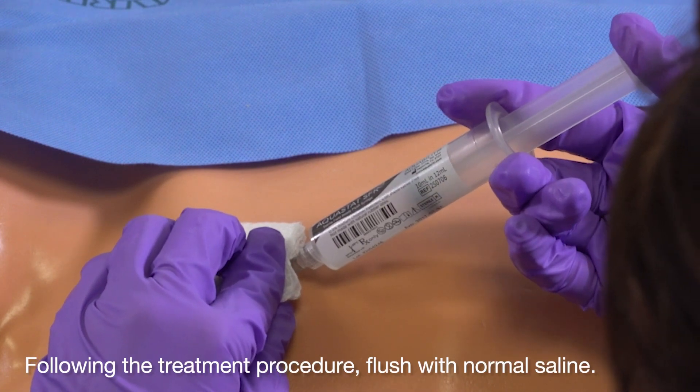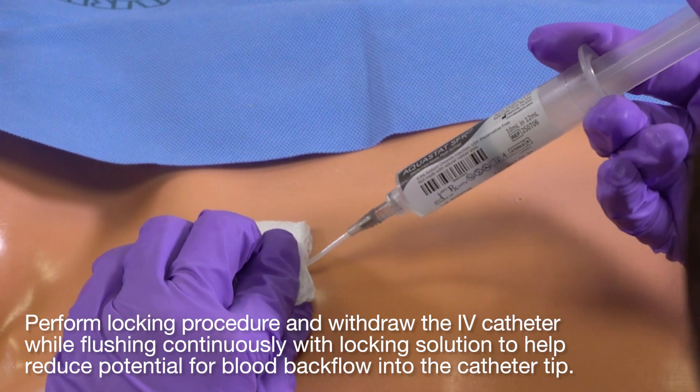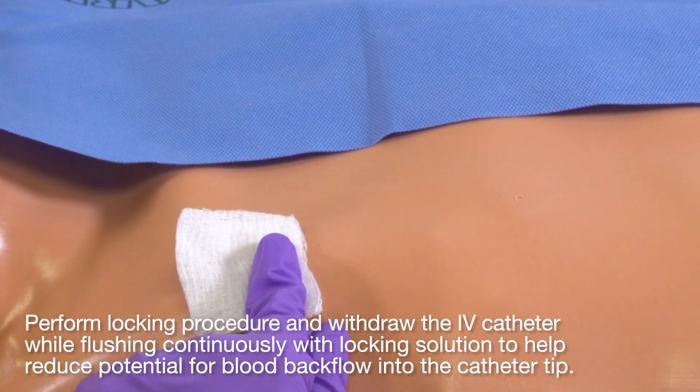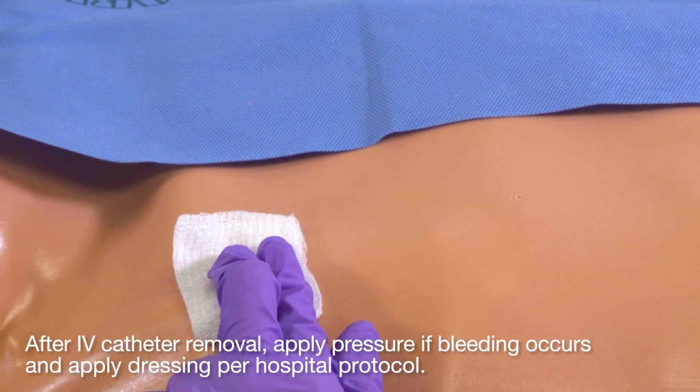Following the treatment procedure, flush with normal saline and perform the locking procedure. Withdraw the IV catheter while flushing continuously to help reduce potential for blood backflow into the catheter tip. After IV catheter removal, apply pressure if bleeding occurs and apply dressing per hospital protocol.